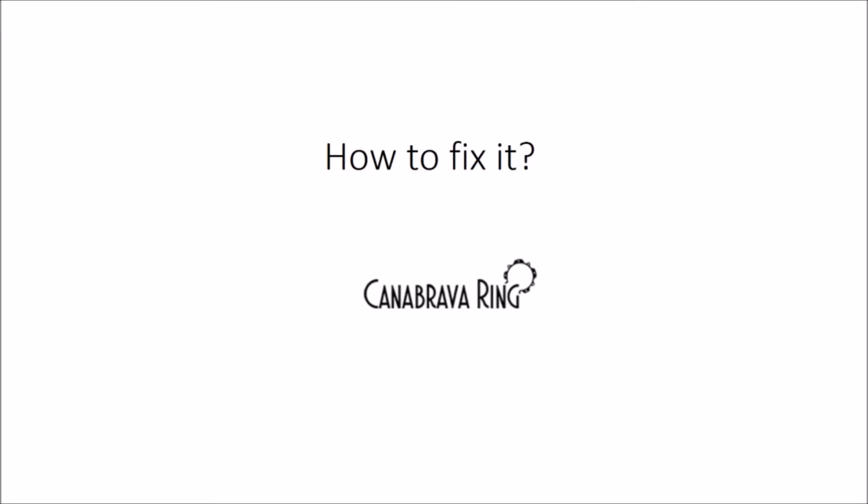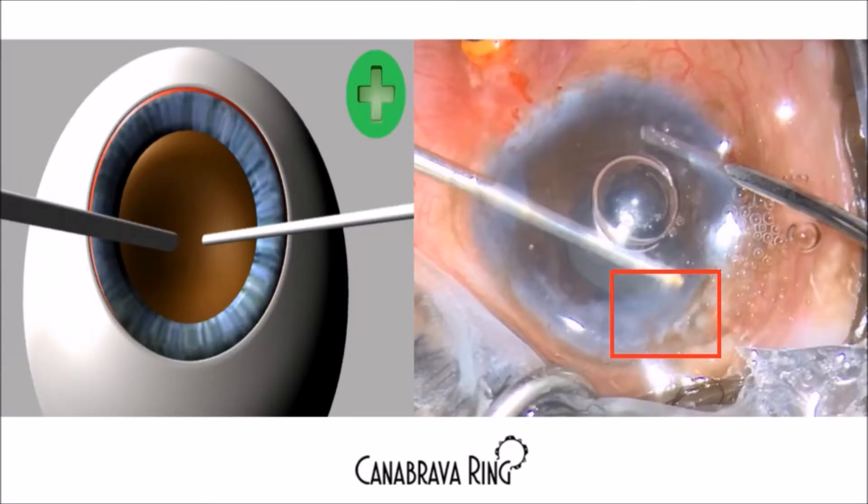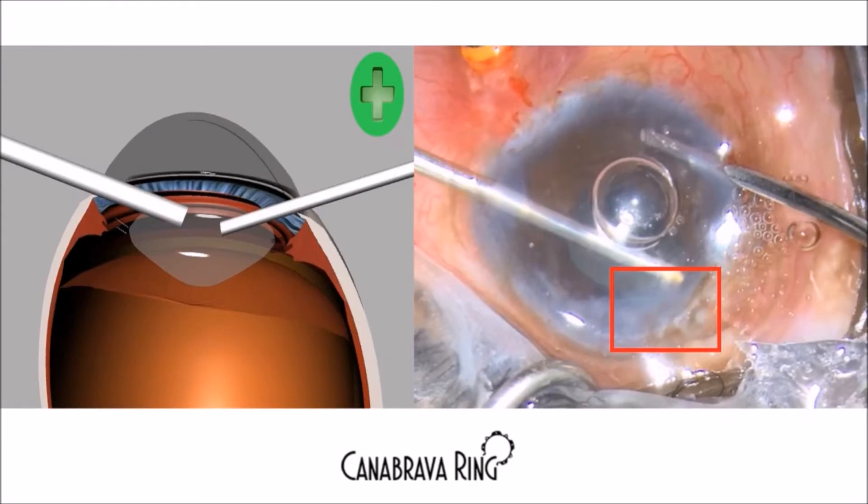So how do you fix it? As you can see in the right image, it is important to make two new incisions of 1.5 to 2 millimeters to seal the tip of the vitrectomy probe. You can see in the red square how you can use this new position to clear the vitreous at the main incision. This shows how important it is to make new incisions.